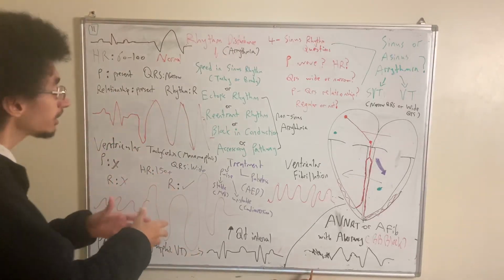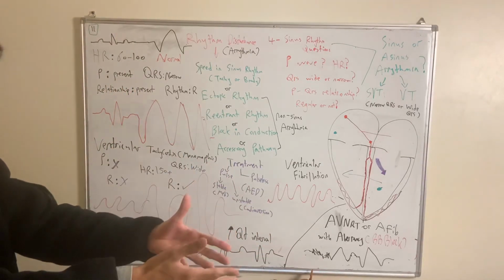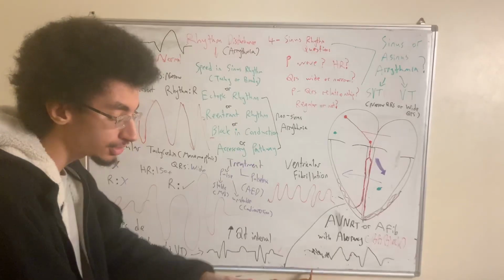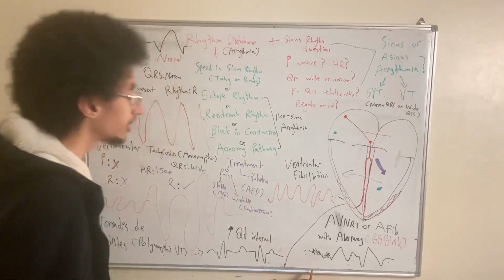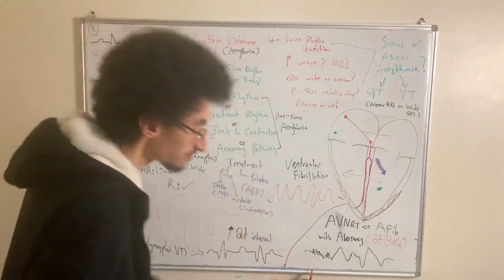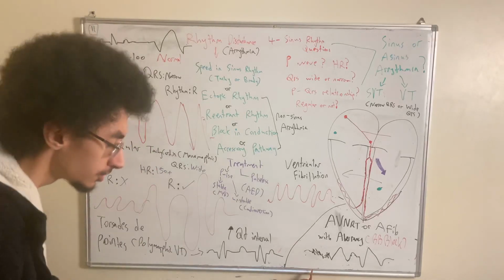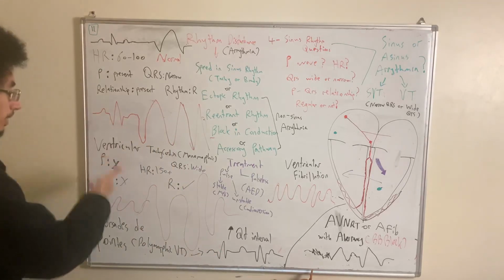So, when I attach a patient who's in cardiac arrest, he's unconscious, I'm following the BLS algorithm, I'm following advanced cardiac life support, I'm following the tachycardia algorithm. Let's say this patient is unconscious and I attach this patient to a defibrillator machine, an AED. The defibrillator machine will show me the rhythm. Is it shockable or non-shockable? Do I give him the shock or do I not give him the shock? What does that mean? Well, let's summarize the management.